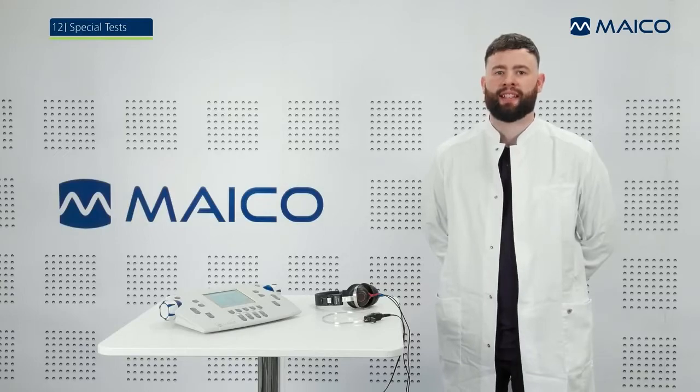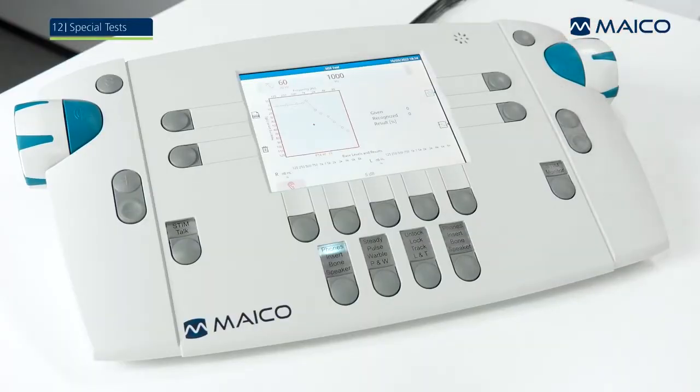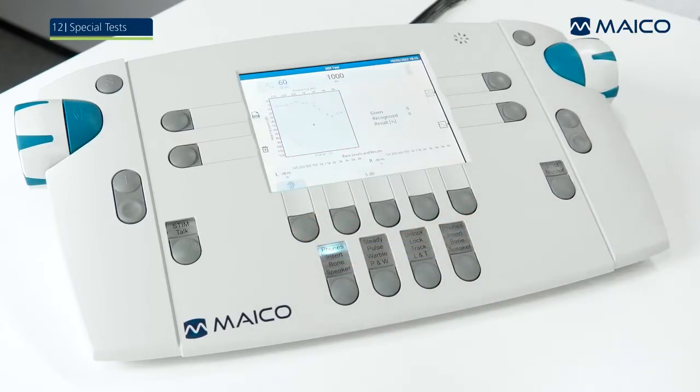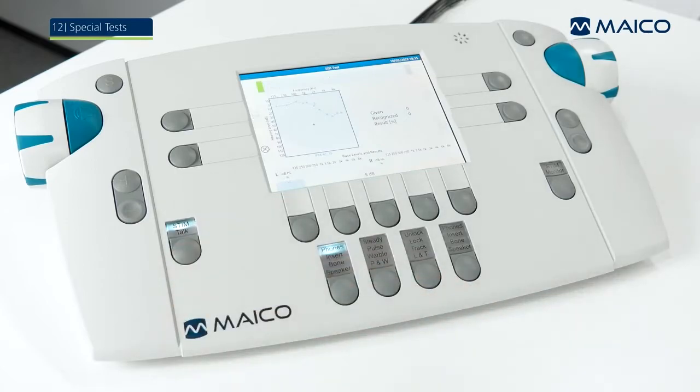The Short Increment Sensitivity Index test, or SISI test, is an automatic recruitment test. Set the ear side and frequency to be measured and the required level. The automatic measurement method is started using the stim button. The level of the tone is increased by the set increment during the test. Instruct the patient to press the patient response switch when an increment is heard.